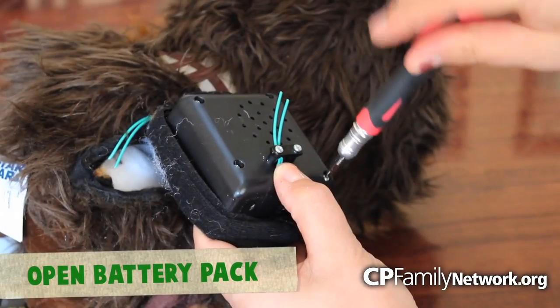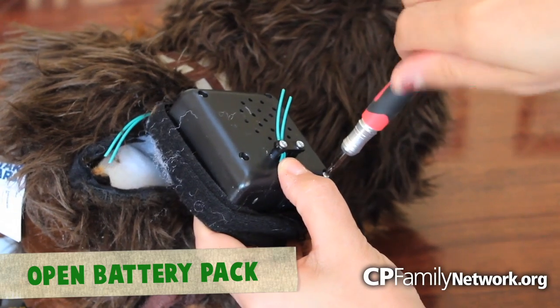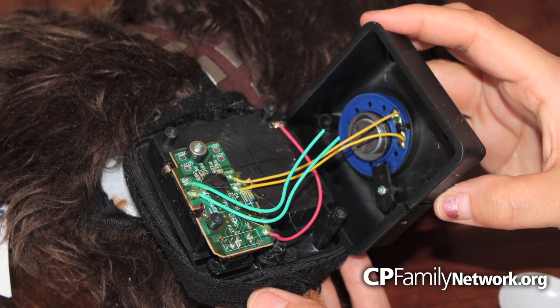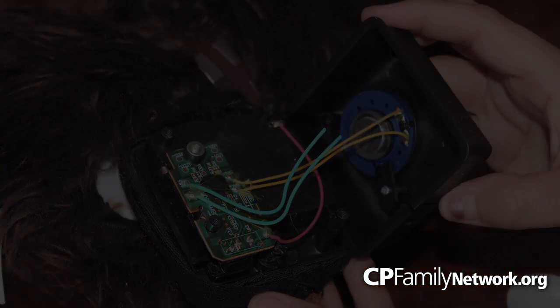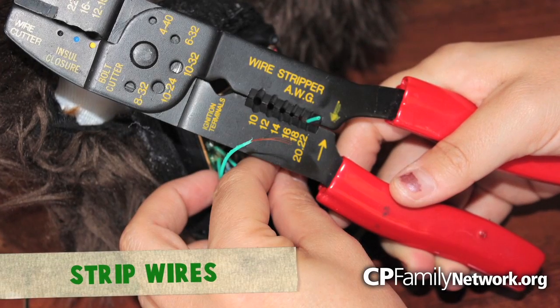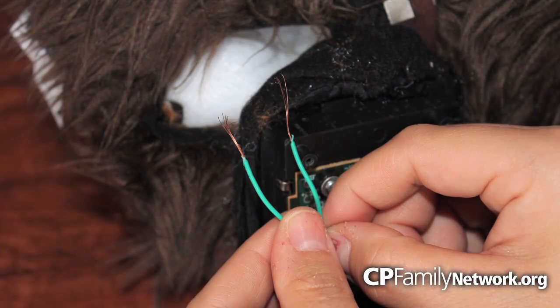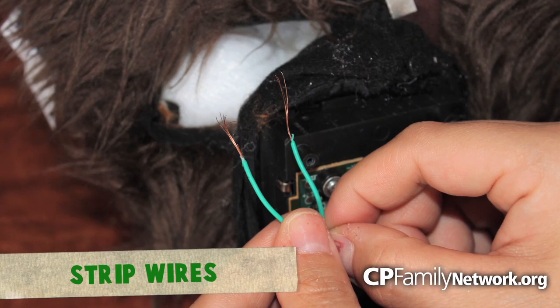Now, unscrew the back of the battery pack to get to the bottom of the wires. Here you will see them connected to the circuit board. Use a wire crimping tool to shred the sheath that houses the wires. After you remove the protective sheath, you are left with two copper wires just like this.